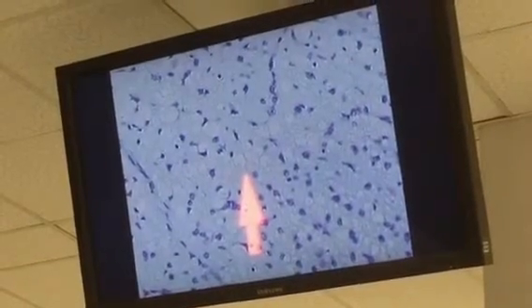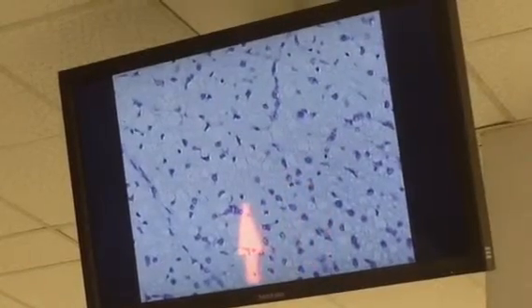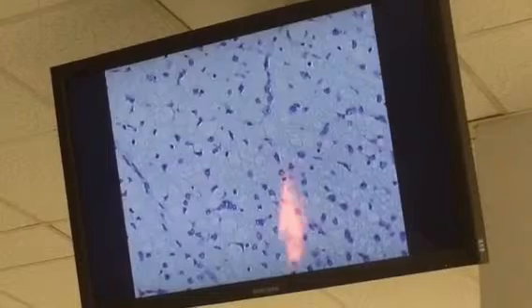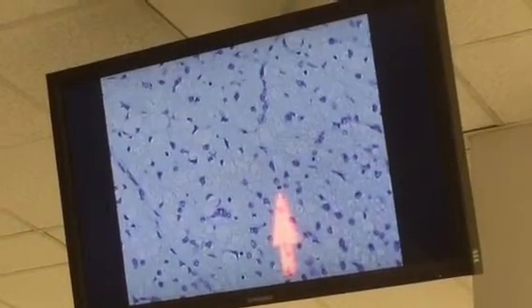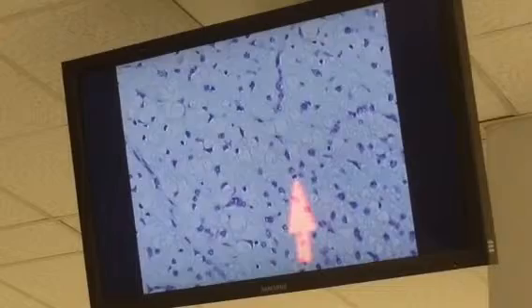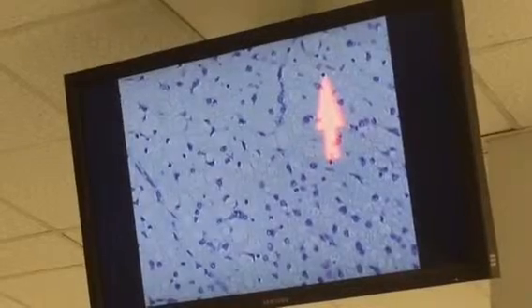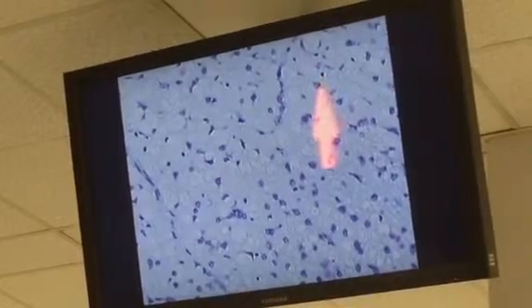Now the purple dots are going to be two things. Oligodendroglial cells, like this one right here, and directly above it, an astroglial cell. So there's astroglia in the gray matter and the white matter, but of course we expect to see a lot of oligodendroglia in the white matter because they're making segments of myelin. Here's another example of an oligodendroglial cell next to an astroglial cell.